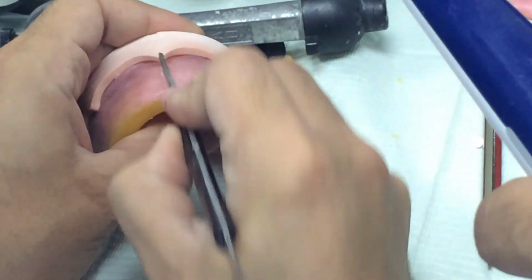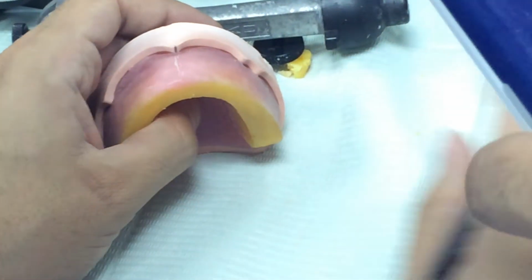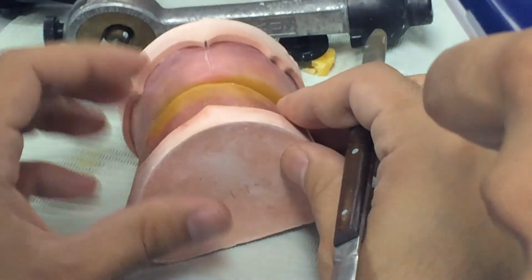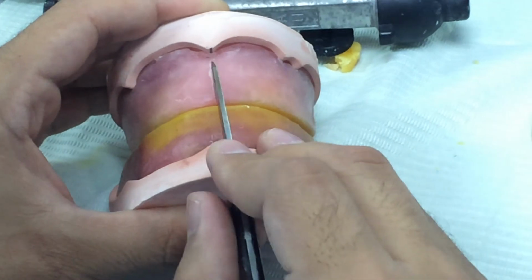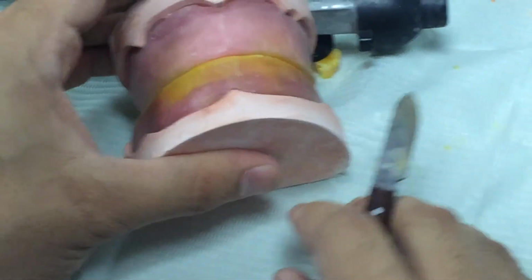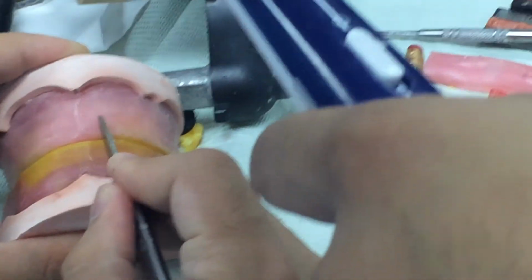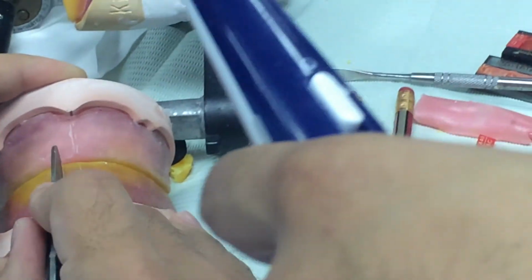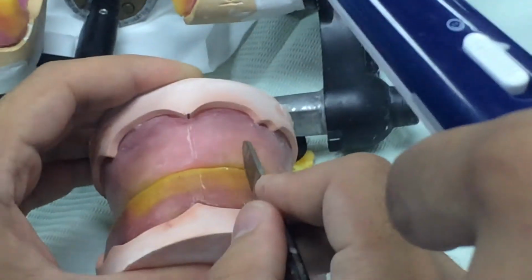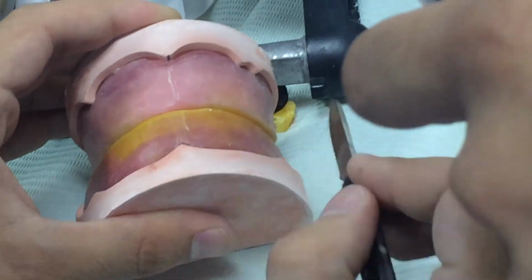After we draw the midline, we have to go down there, the same line. And from this you have to start your central. Let's say your left central and then right central, left lateral, right lateral, canine to canine.